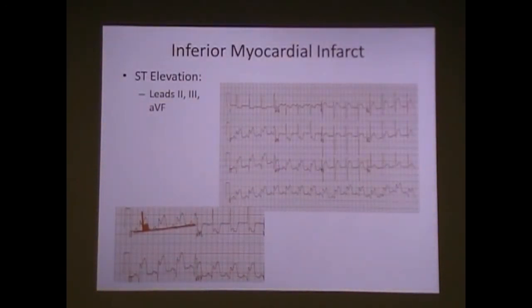So if I'm taking it, my isoelectric line is right there. I know I'm kind of shaky. J point, boom, right there, and do your measurements, and that's some nice ST elevation.